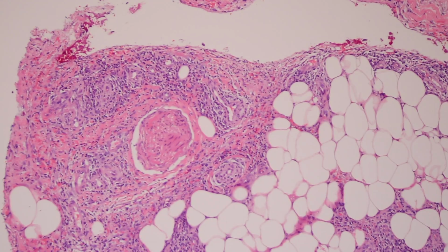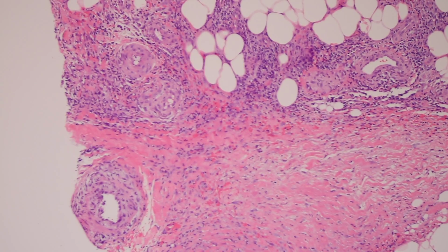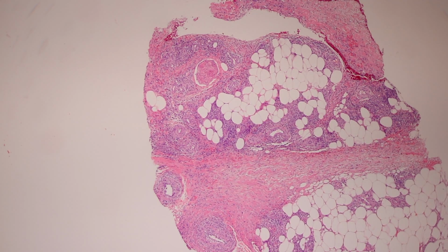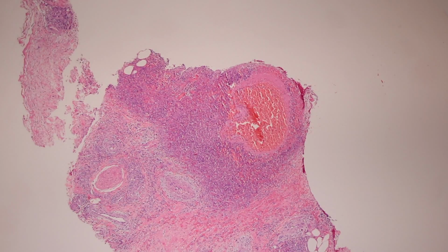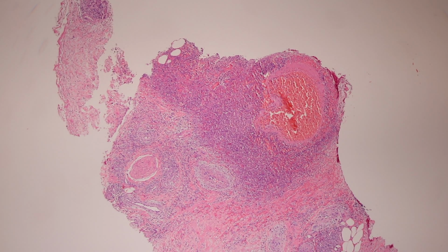P-A-N. In fact, whenever I see fibrosis and inflammation that's limited to the area right around the dermal subcu junction, I always think, could this be PAN? Especially if they're describing painful, tender nodules clinically. I'll go and cut deeper levels and look to see if we can find any lesion like this that would represent PAN. So clinically, usually the dermatologists are very astute on picking up on PAN because of these painful, tender nodules. And there are other things like panniculitis that can have that presentation.